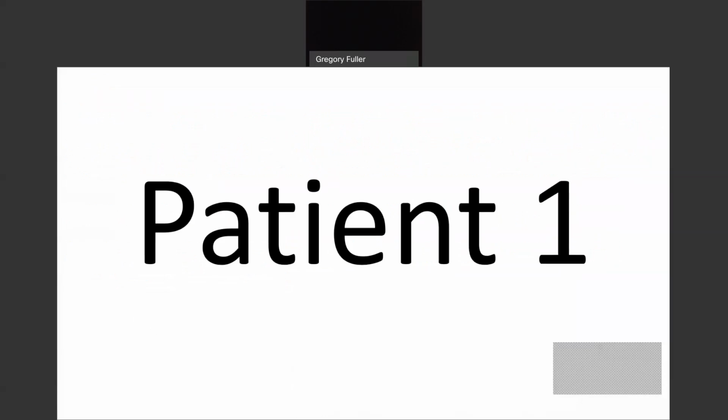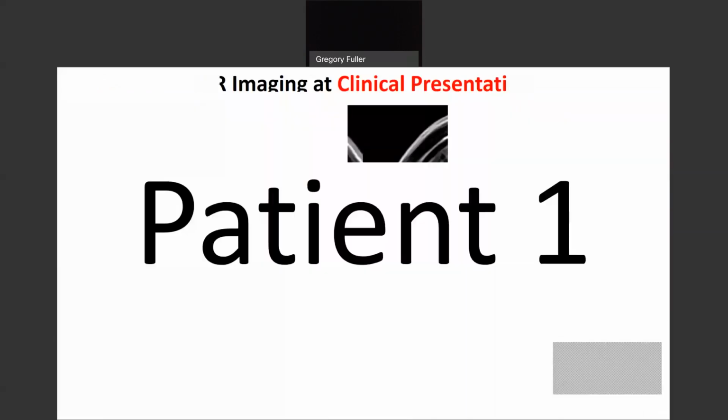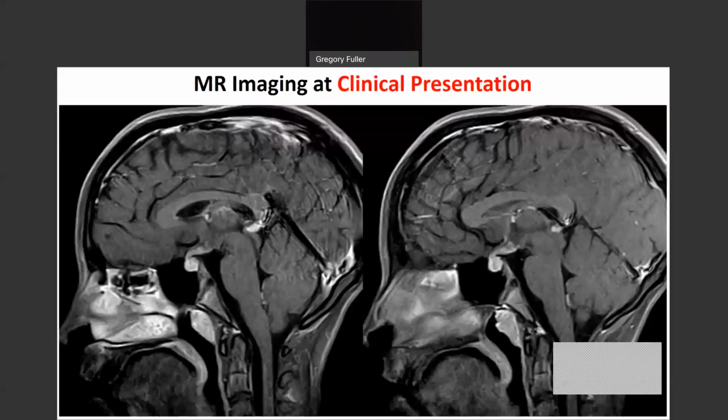I think we're ready to move on to patient 1. Okay, let's give it a try. All right, I'm going to show you images, and then I'm going to ask you some questions. Or, I'm sorry, did I already ask a question? No, patient 1. Here we go. This is the MR imaging and clinical presentation.